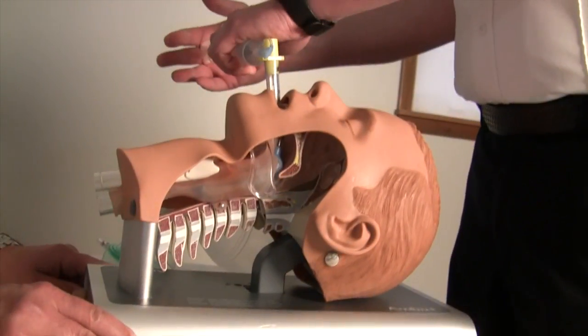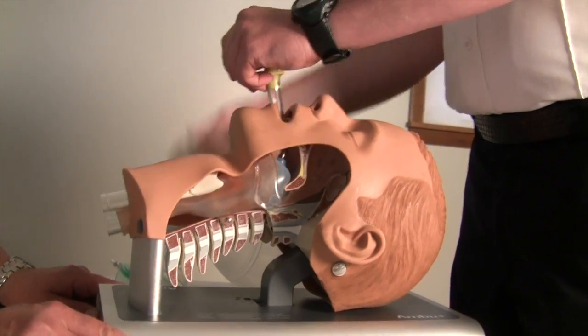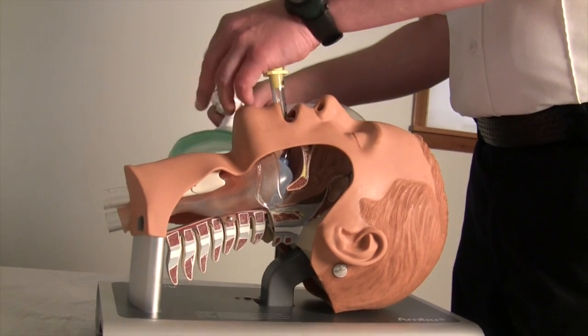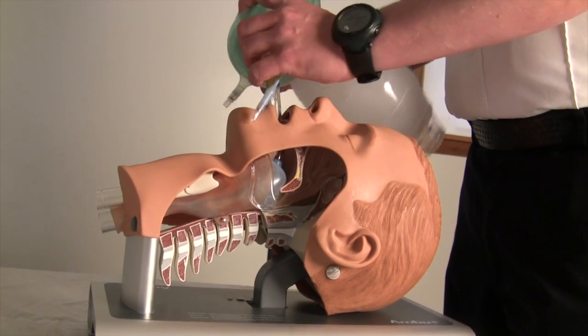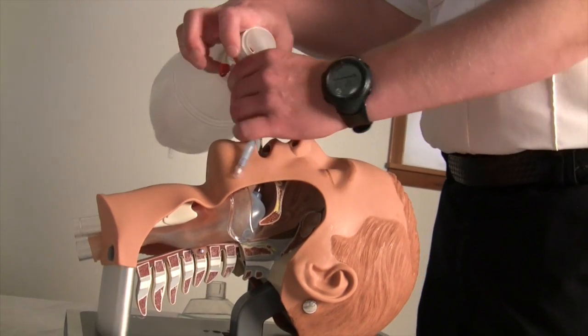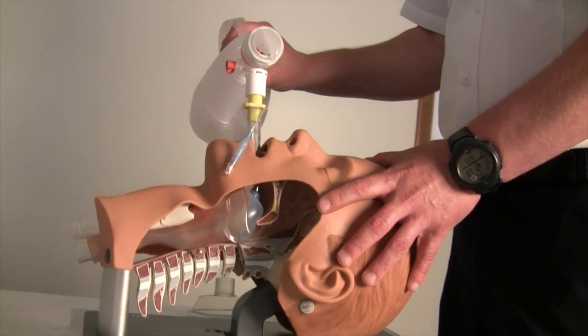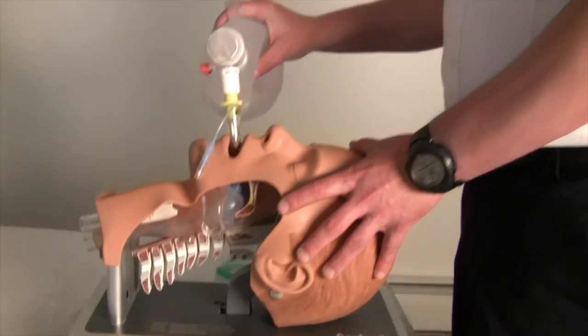Without exerting excessive force, advance the tube until the base of the connector is aligned with the teeth or gums. Inflate the cuff using the correct amount of air: for a number three, 50 milliliters; for a four, 70 milliliters; and for the five, 80 milliliters. Confirm placement with auscultation of lung sounds and capnography.